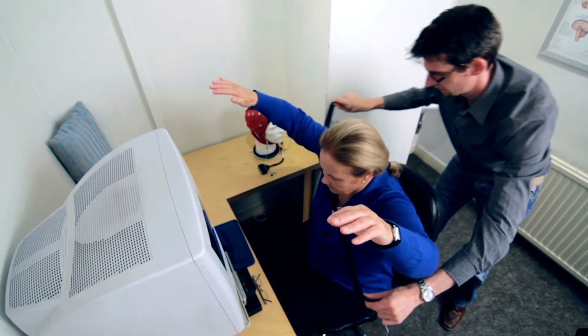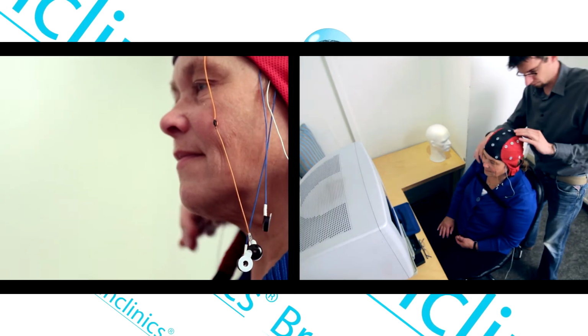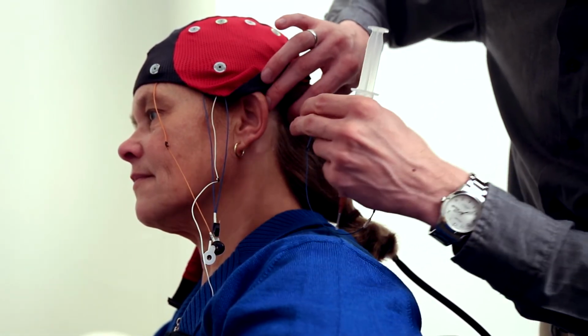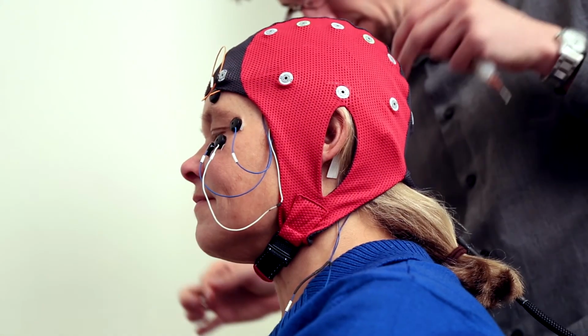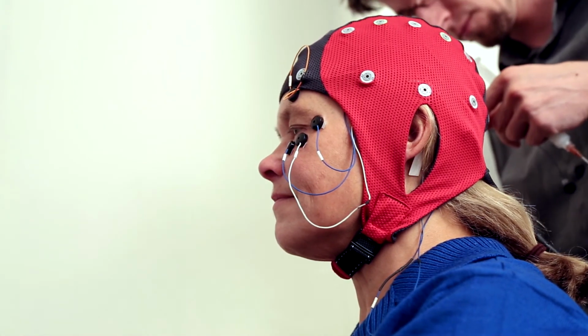The client is then fitted with a strap around the chest to measure respiration. The researcher places a specially selected cap on the client's head. This cap contains electrodes that measure brain activity. The cap also contains a number of electrodes that are attached to several places on the face, such as around the eyes and the jaw. Among other things, these electrodes measure eye movement and muscle tension.